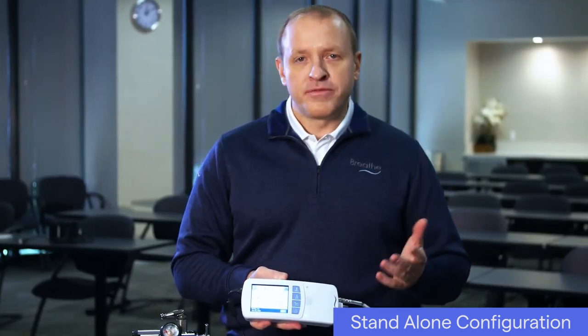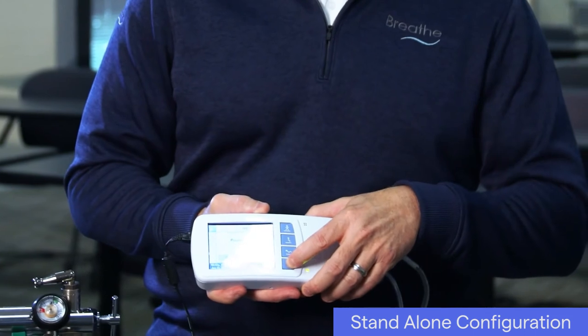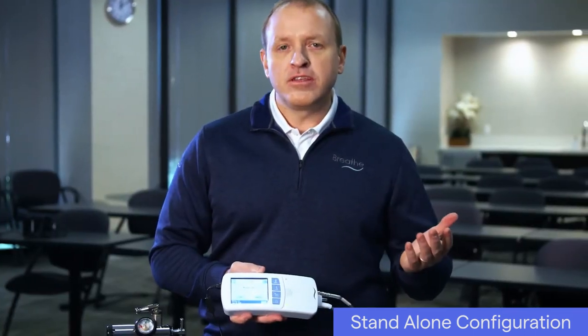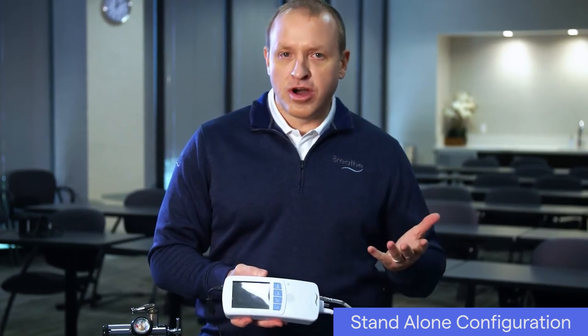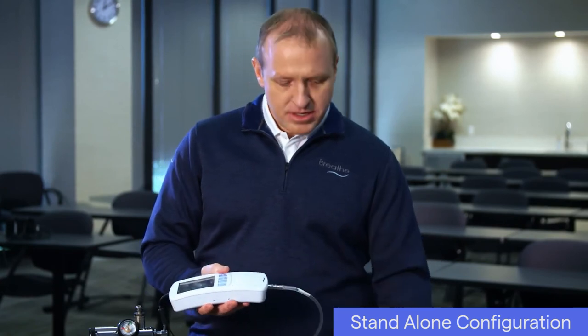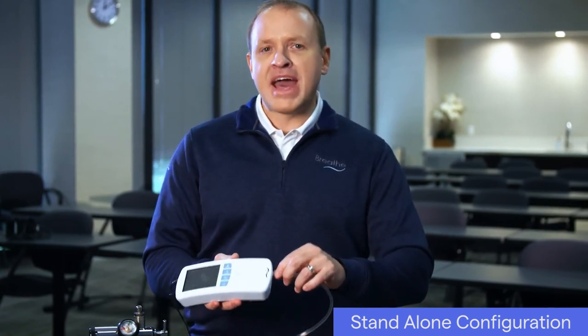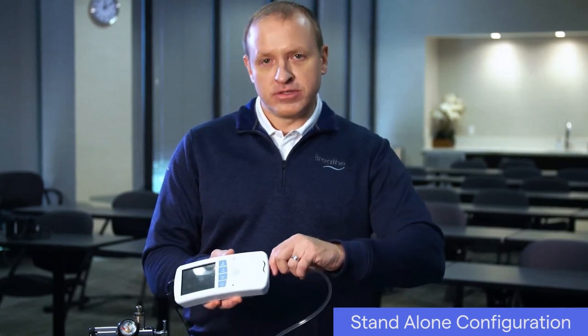To power off the ventilator, push the power button for about three seconds until a confirmation screen appears. Choose OK and the ventilator will turn off. When not in use, turn off the oxygen supply according to the regulator and cylinder manufacturer's instructions. Disconnect the interface and then disconnect the oxygen hose from the ventilator by pulling back on the quick connect end of the hose.